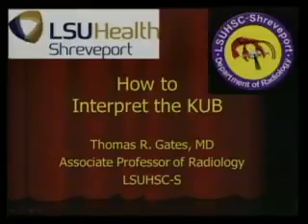What Dr. Nolan and I have always said is, in residency, people love the high tech, the CTs, the MRIs, the interventional. They don't really like plain films, and they always start with plain films. You can see a lot of stuff on radiographs that you'd be surprised if you really look for them. And so I'm going to show you how I interpret the KUB and then show you some cases.